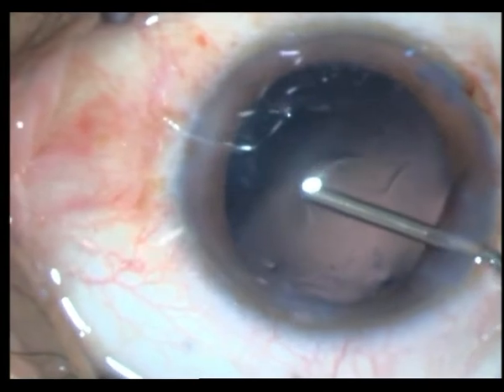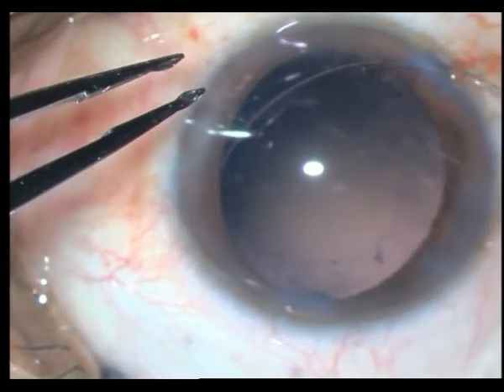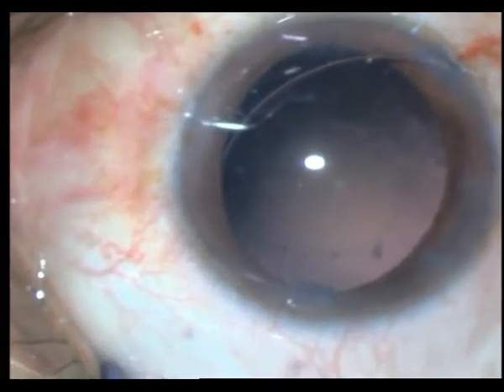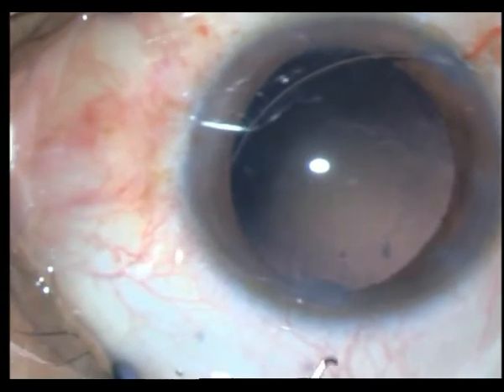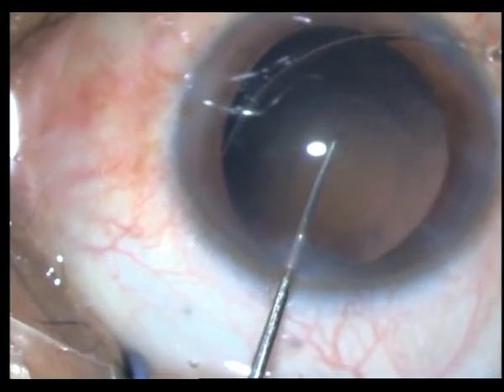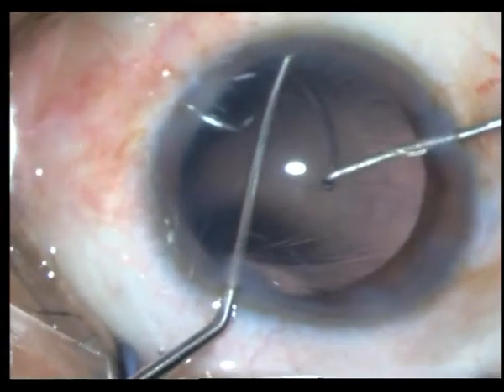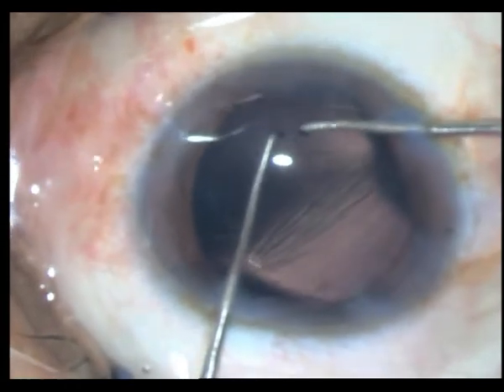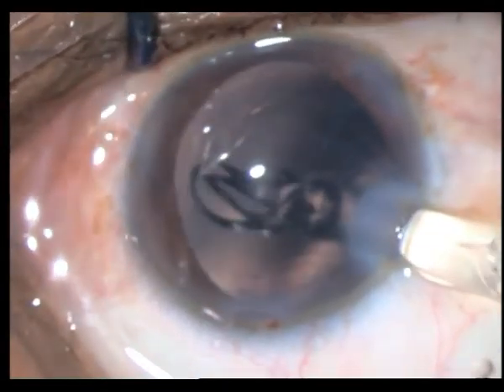Luckily I recognized it. I pull out further, fill the bag with OVD, pushing the lax part of the bag back into position, then put in a CTR ring. You can get away without putting the CTR ring, but it's better to err on the safer side. The rhexis is small, so if you just leave the CTR it may escape into the sulcus — you have to catch it by the more distal part, pull it back into the bag, release it into the bag. This must be done as a bimanual procedure.